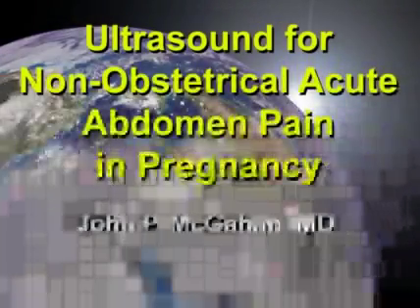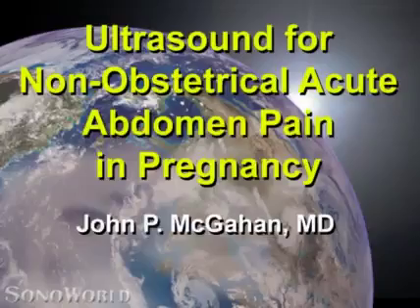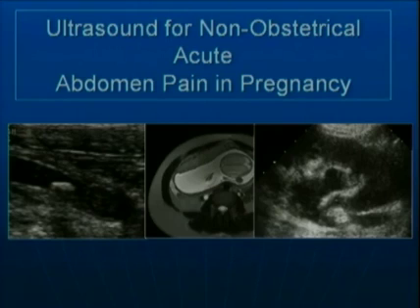Today, I'm going to talk to you about a problematic area, which is how do we diagnose etiologies of pain in the pregnant patients that are non-obstetrical causes of pain. I'm going to talk to you today about ultrasound and non-obstetrical acute abdominal pain. So I'm not going to talk about OB/GYN causes, but all other causes of pain.